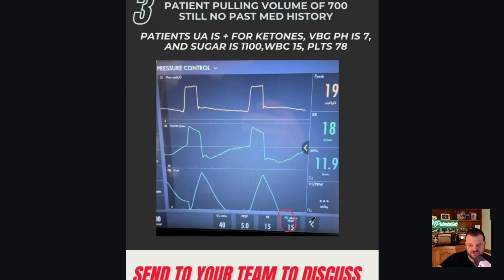So PEEP as a starting point and then adding pressure on top of it, which is your delta P or your pressure control or your driving pressure, and getting a volume. If the patient's active in that, then the amount of volume they're getting is not connected to just that delta change in airway pressure, because we didn't factor in the delta change in intrathoracic pressure from the diaphragm contracting.